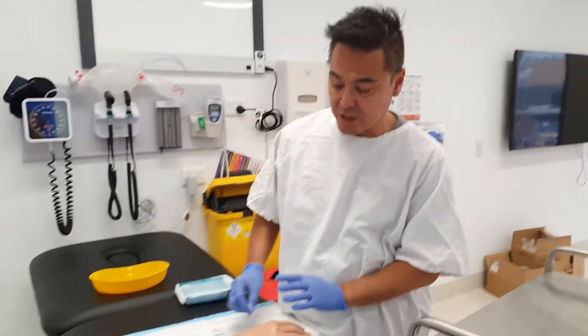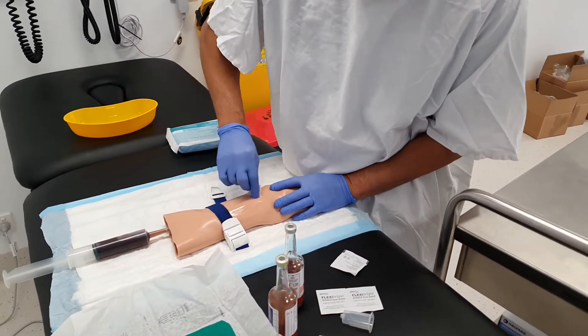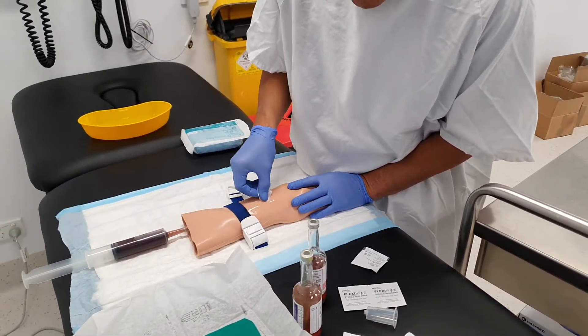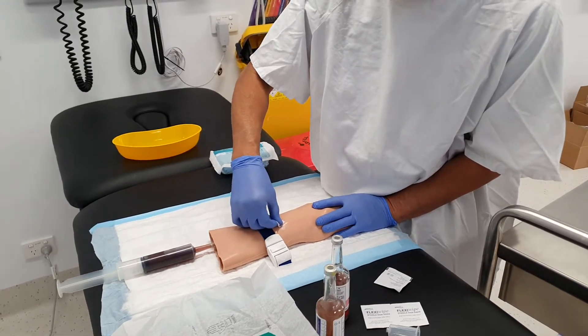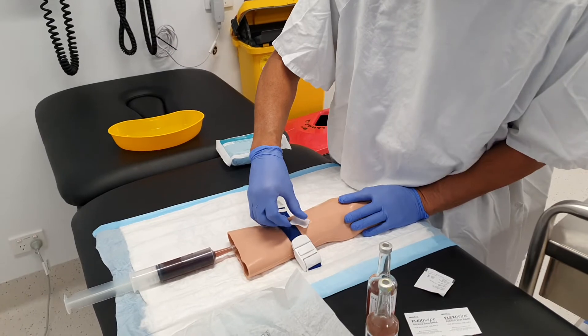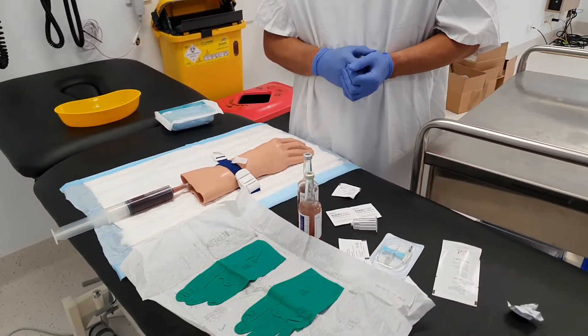Before I even start the procedure we obviously need to pick a suitable site to get the blood from, and I like to give the area a good clean. I'll give it a good rub with the alcohol wipe, and looking at the wipe I want to make sure that there's some surface dirt on there. I'm also pointing roughly at the area where I'm going to be taking the blood from, and then I'll start getting ready.